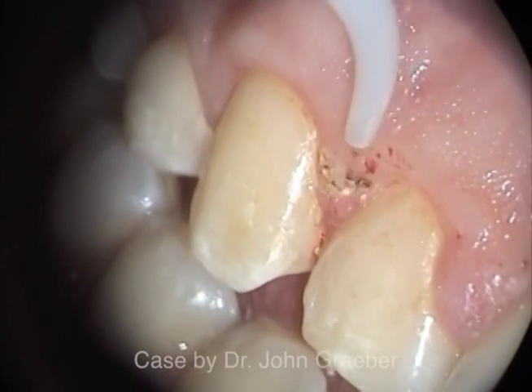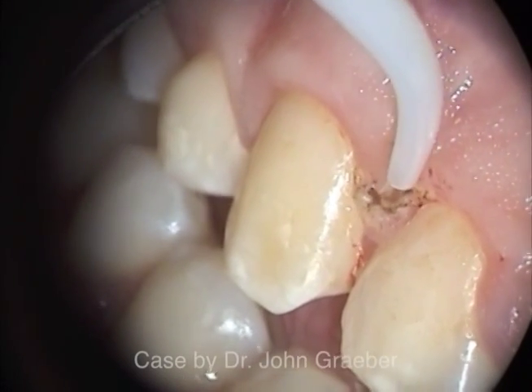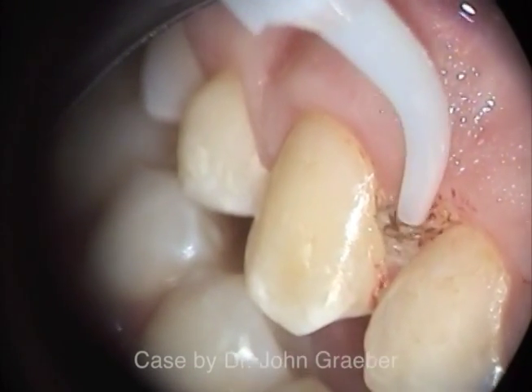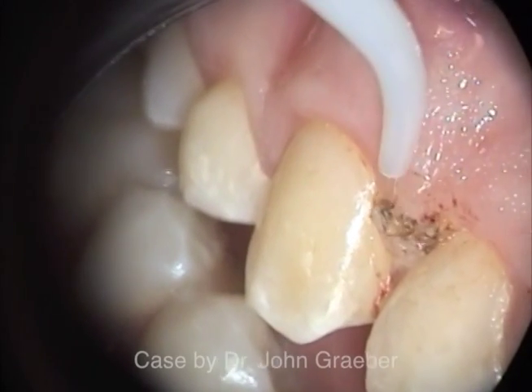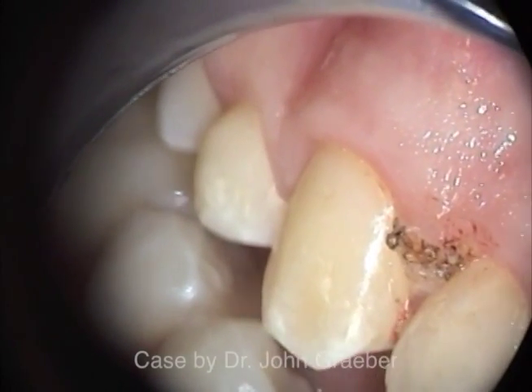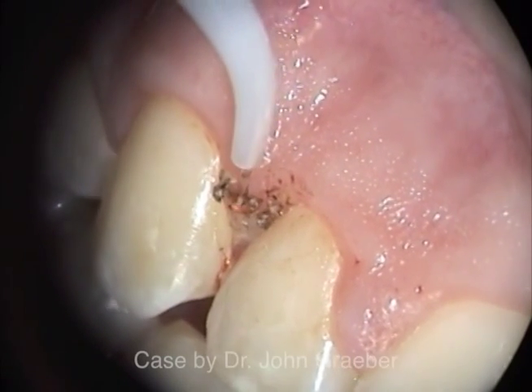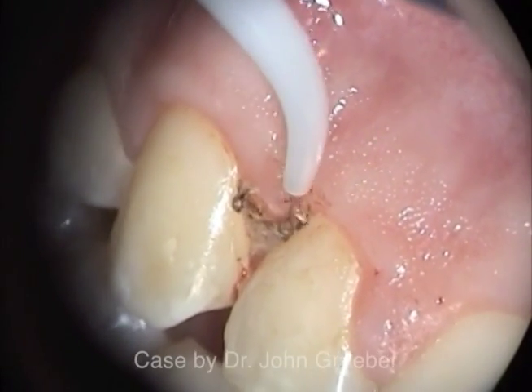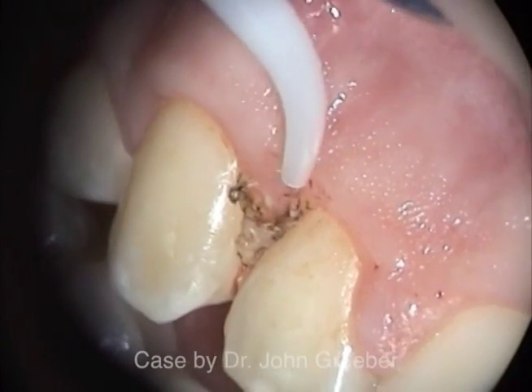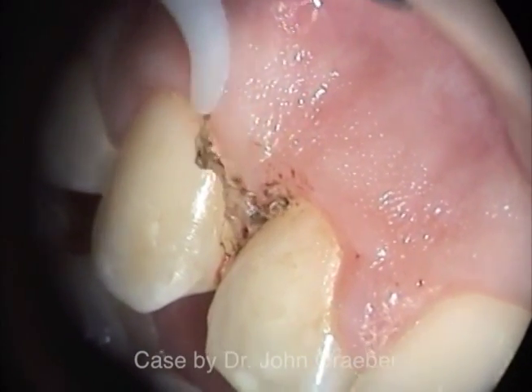Diode lasers are low-powered devices. It is far more efficient to remove tissue by the excision method. If the laser fiber is held in the same plane as the final tissue contour, far less unintentional thermal damage will occur, and the tissue removal will be more efficient.